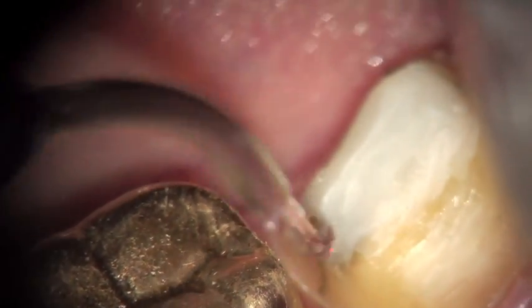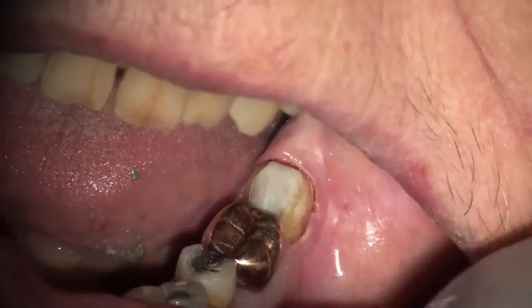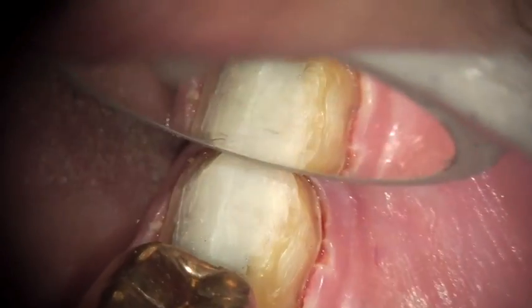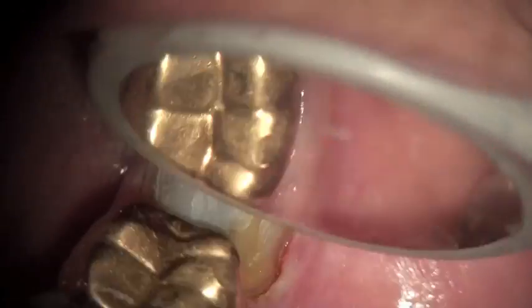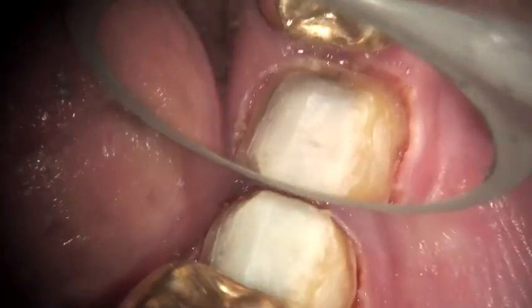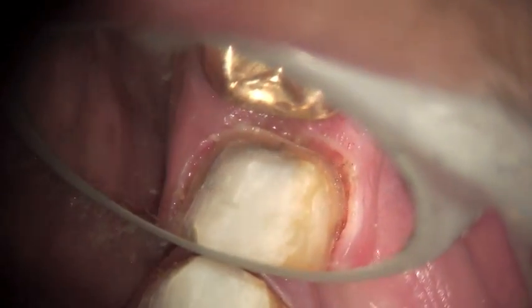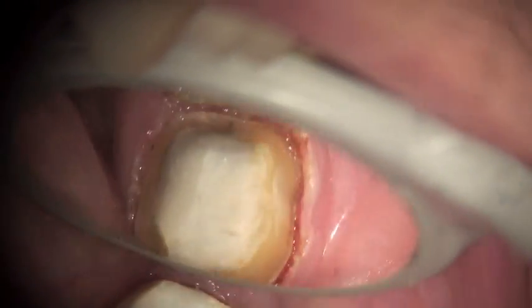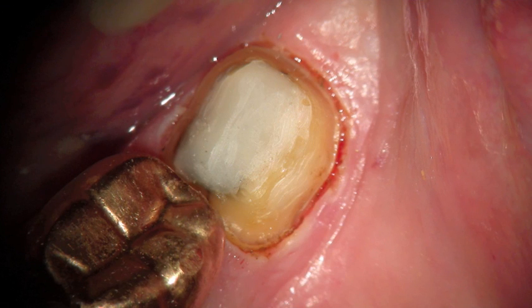You can see here the blue handpiece and the laser. We're almost complete here with the actual view. You can see afterwards we've completed the troughing, using the mirror to show a little bit of the view. Now we're ready for the impression. This is the tooth after troughing and ready for impressions.